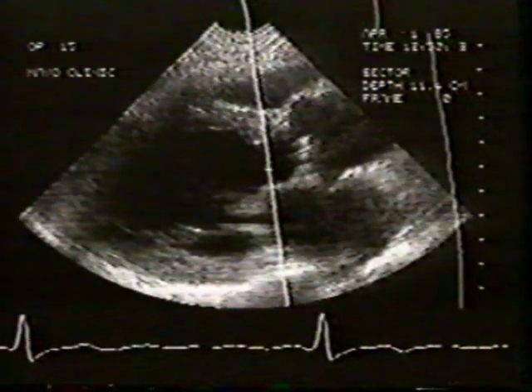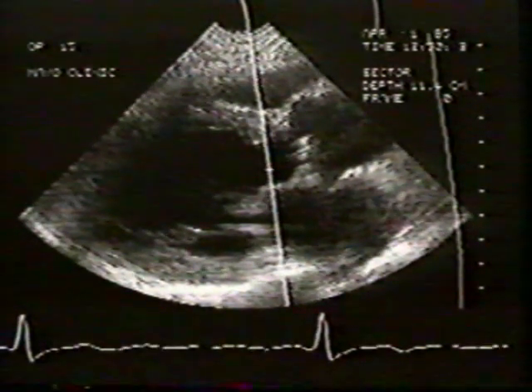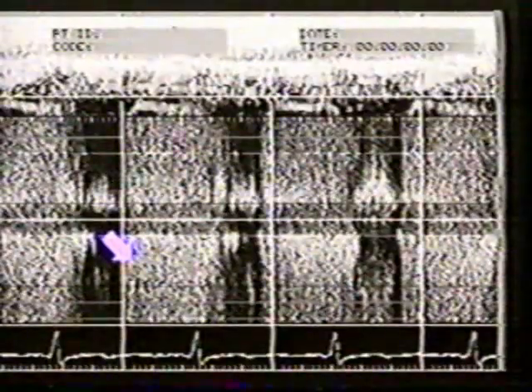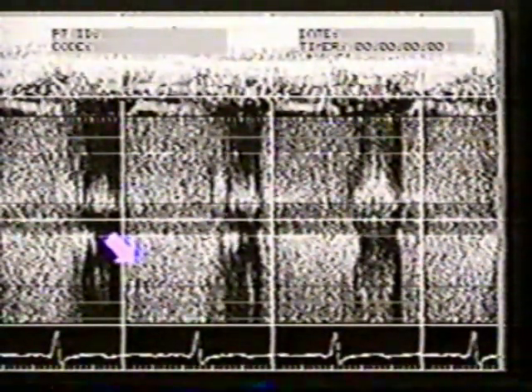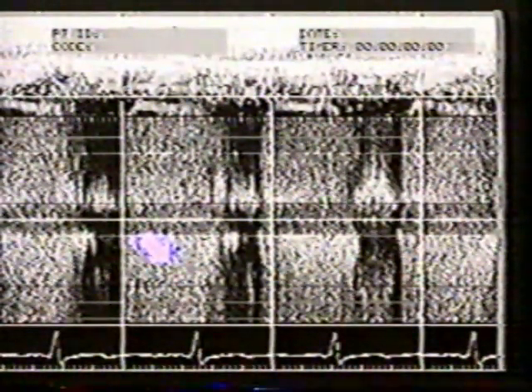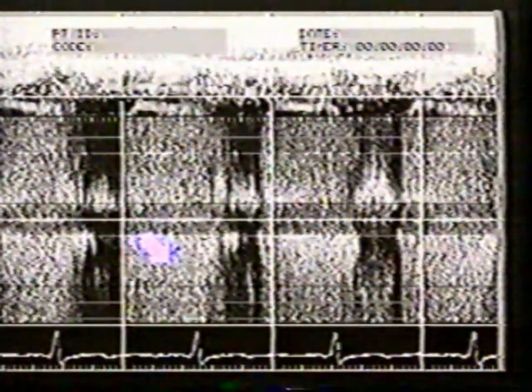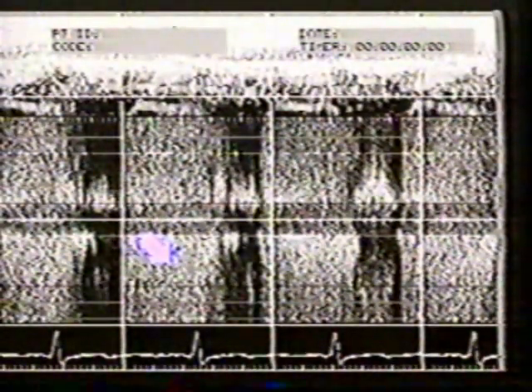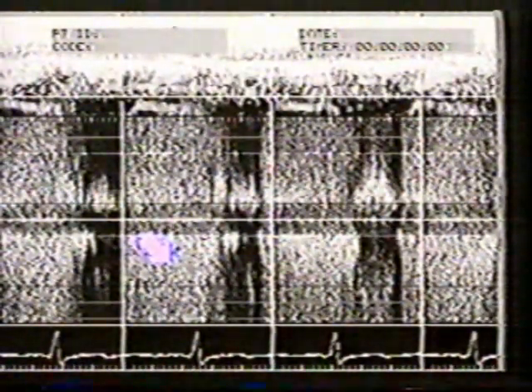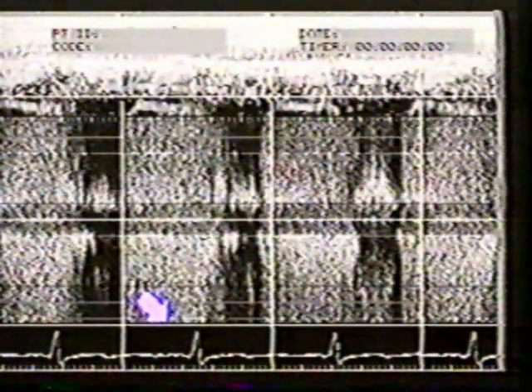For detection of aortic regurgitation, a pulse sample volume has been placed in the left ventricular outflow tract. This is the resultant pulse Doppler spectrum, which confirms the presence of aortic regurgitation. The signal is holodiastolic, and the filled-in envelope indicates turbulence. The turbulent regurgitant flow is multidirectional, so we are able to easily detect it even from this parasternal vantage point, which is nearly perpendicular to the left ventricular outflow tract. The aortic regurgitant jet is characteristically high velocity, which results in aliasing in the pulsed mode.